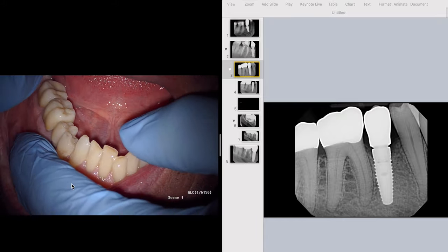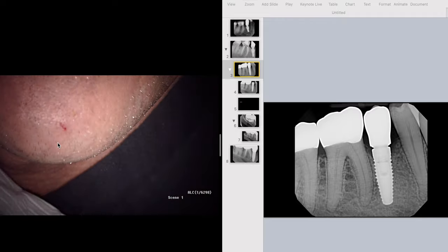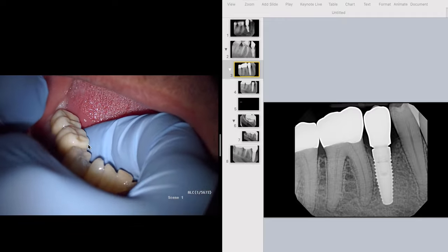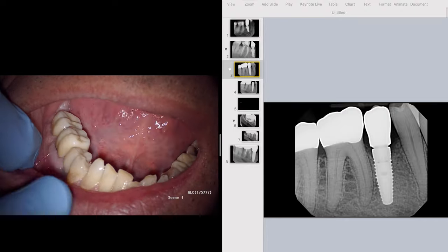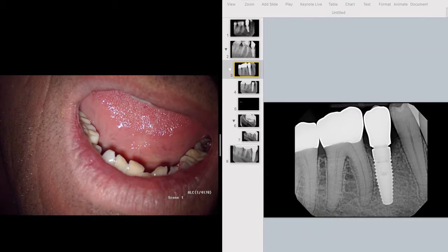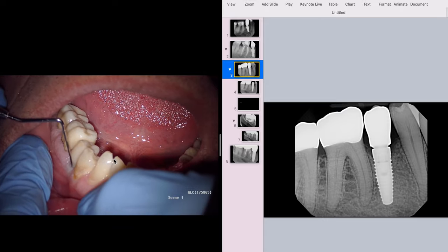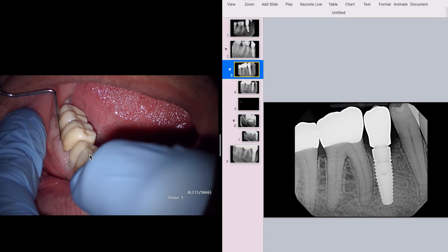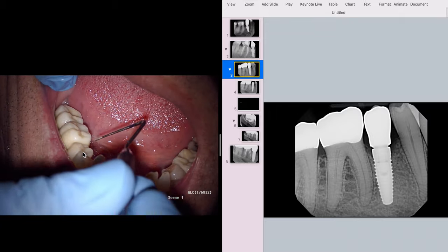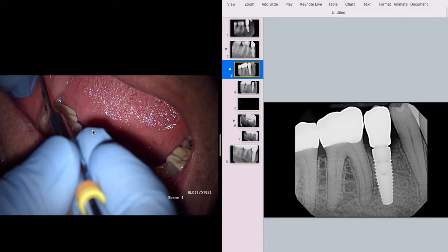Let's take a look at the clinical exam. First off, we're going to do palpation — palpating the buccal mucosa and vestibule, then along the lingual surface of the mandible. Pretty quick, no pain at all. Everything looks good. We're going to do our probing depths now. I'm looking for any bleeding on probing, any generalized deep probing depths, and also any deep probing depth that might indicate a cracked tooth.